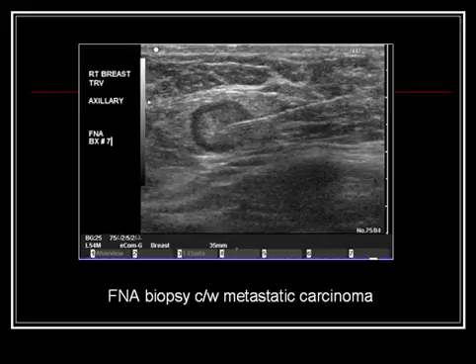And as a result, again, we are trying to reduce the cost of medicine by performing these procedures. So this also seems to have a great value, especially in breast imaging. Possibly in any other cancers where the lymph nodes are often evaluated, such as melanoma, we may be able to perform elastography on these lymph nodes and maybe make a decision whether we should biopsy them or not at that time.